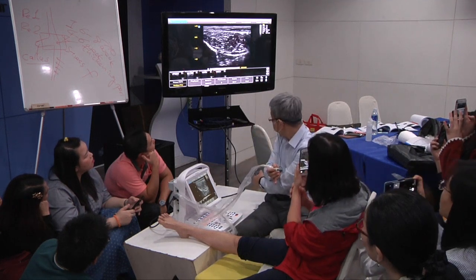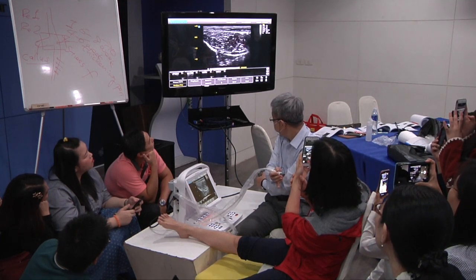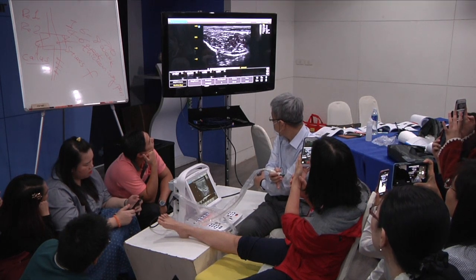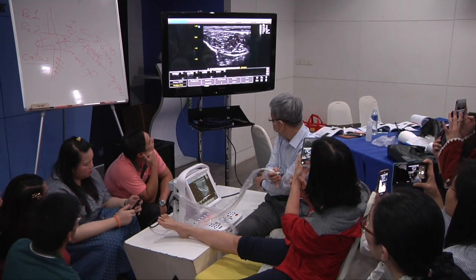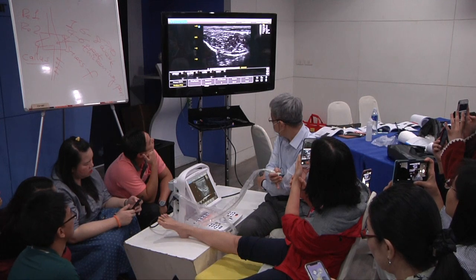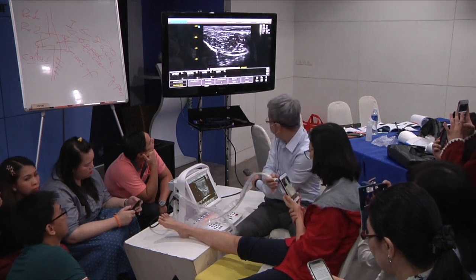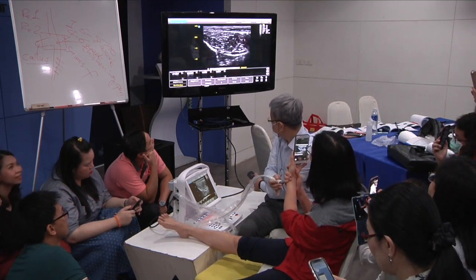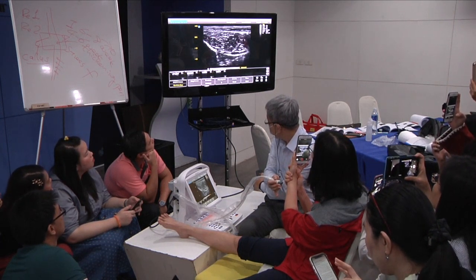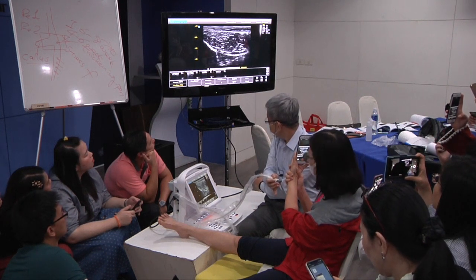This is interosseous membrane. This is tibialis posterior. That's why we say this is tibialis anterior, this is tibialis posterior, because they face each other with an interosseous membrane. This is tibialis posterior, okay? I think someone already noticed the bright layer: the superficial layer is bright, the deep layer is dark, right? There are two layers.